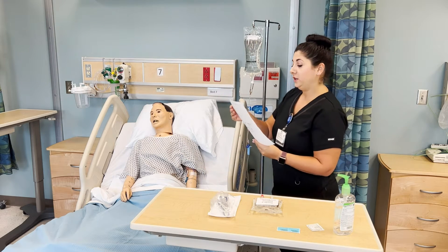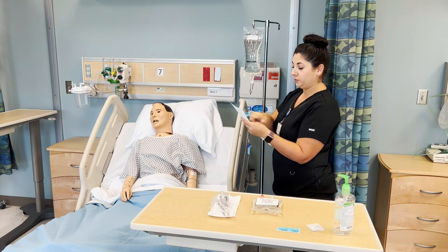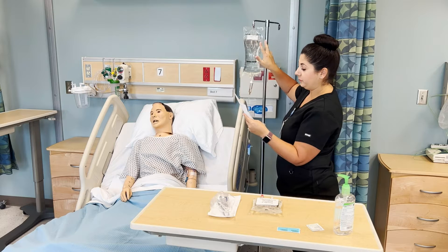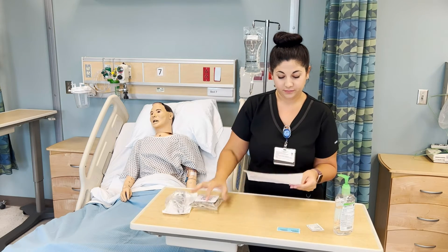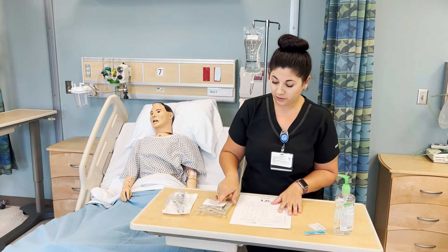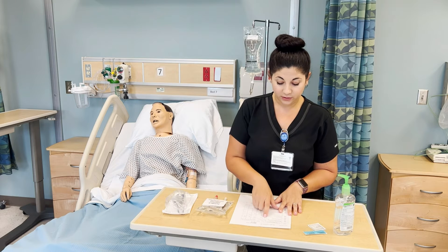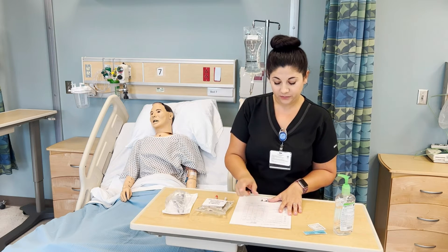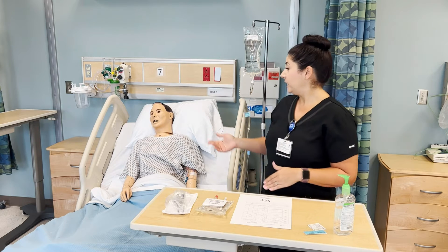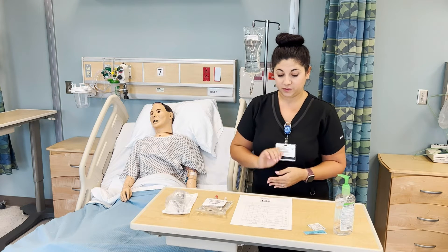I'm going to do my third check of my medications. First, I'm going to make sure that the primary is the same as what I have on my order, reading the medication name on my MAR and on my primary IV. I will do my third check on my medication, reading out loud the name of the medication on the MAR, the name on the medication, the dose on the MAR and on the medication — the route should be IV or IV piggyback — and checking that the time is correct and I know the frequency. I have explained to the patient using my drug cards what the medication is for and what the possible side effects are.